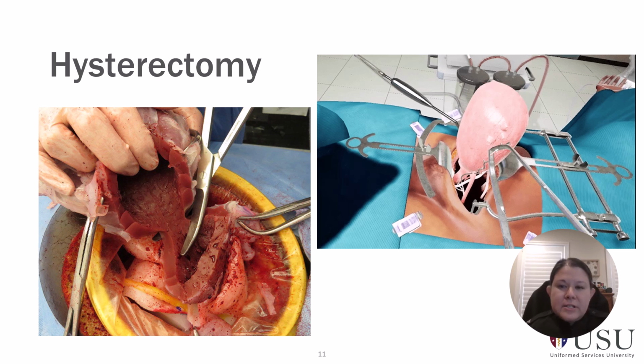And then over here is an example of a virtual reality simulator. So you can see that you're able to simulate an abdominal hysterectomy using a virtual reality simulator as well. So again, some pros and cons of both, but I think definitely options that are available to you as well.